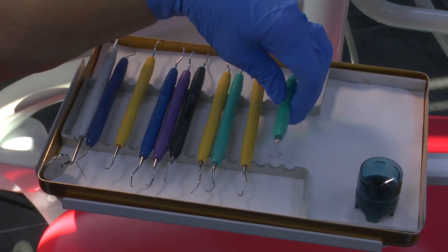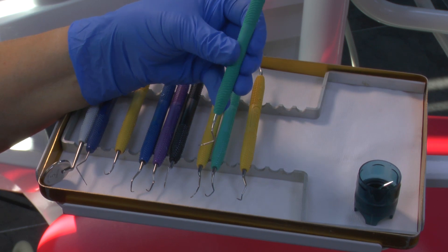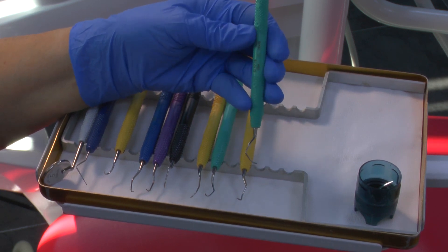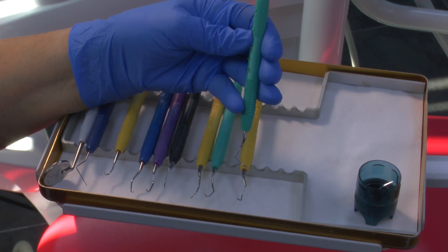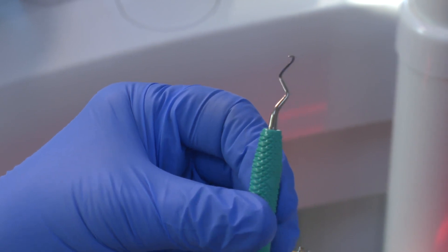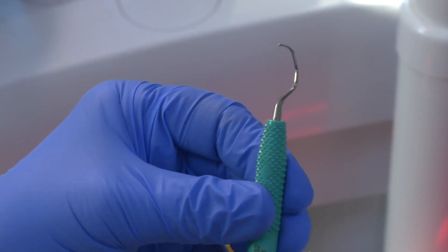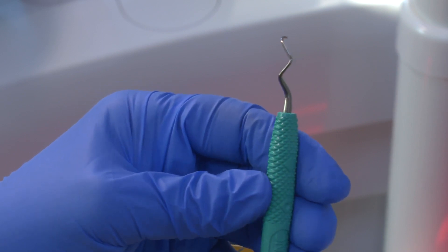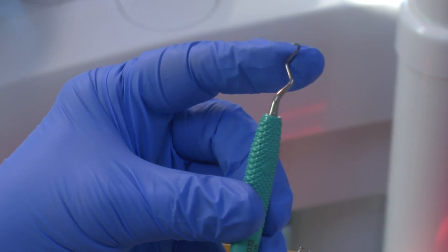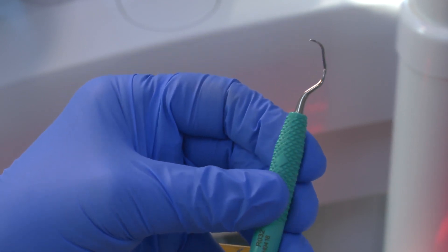The last instrument in the PDT set that I would routinely use is this Gracey for the posterior areas — it's the 17-18. This has a tremendous rake on the neck because this is the one you would use for distals of sevens and distals of eights, as this terminal shank gives you quite good pull against the root and the angle allows you to reach.